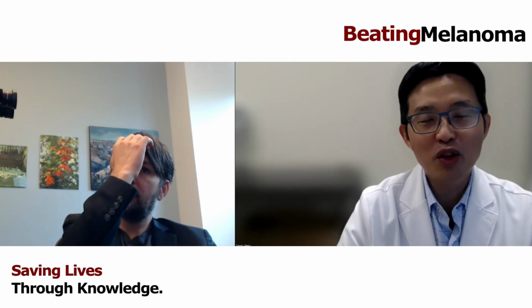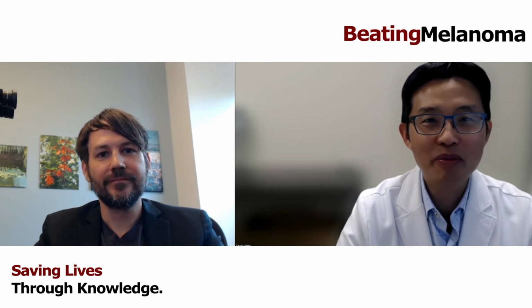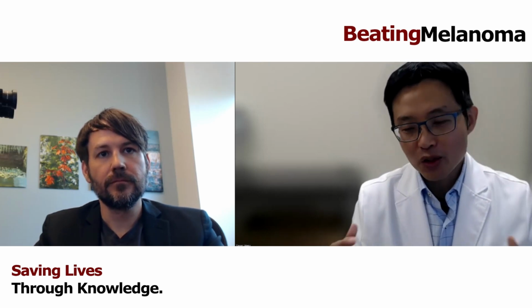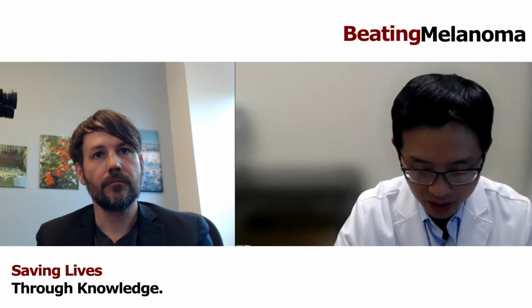That being said, I know that you got a whole bunch of slides ready for us. And this is really great because I think a lot of times I just want the general public to get exposed to, so what does normal skin look like, first of all? And then let's look at perhaps a melanoma in situ, that's a stage 0 disease. And then we get to melanoma invasive. And what is the most important thing: is it ulceration, is it Breslow thickness? And maybe you can even walk us through some of those fine details.